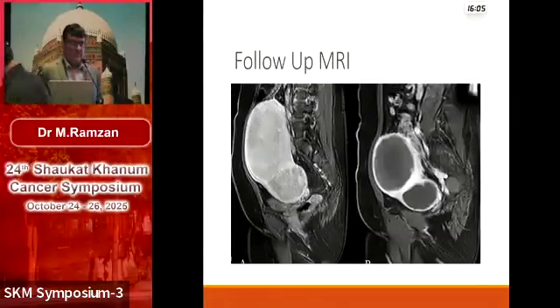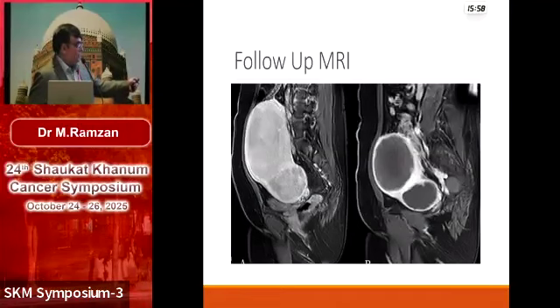So how these appear on follow-up, you can see the MRI on this side. This is the pre-embolization. Not really sure something is there.